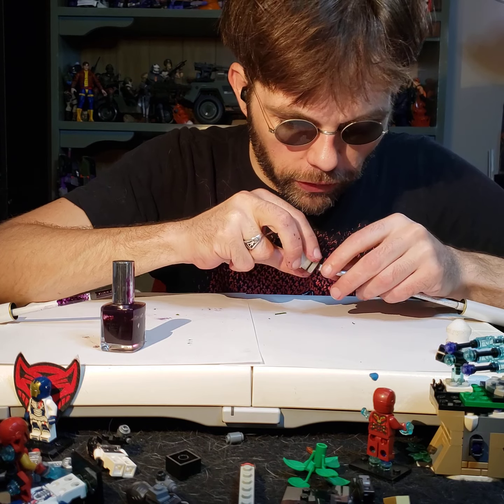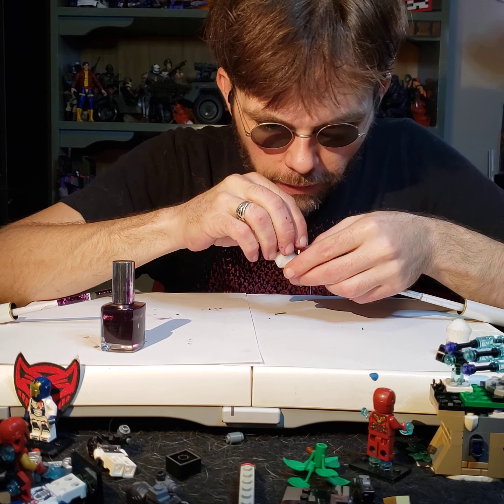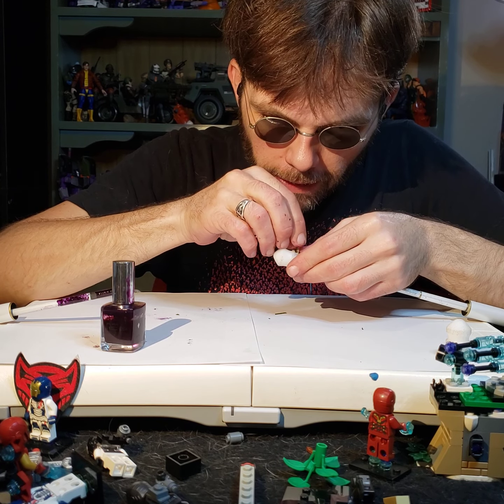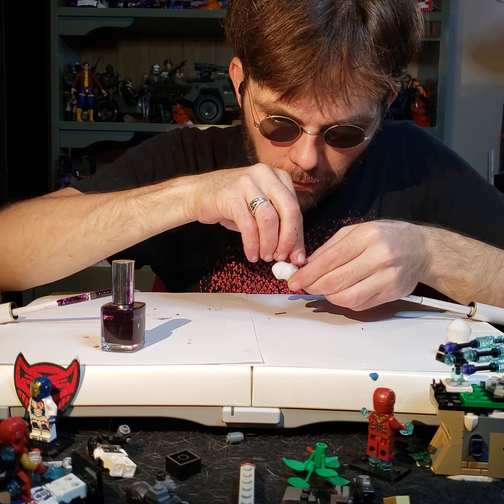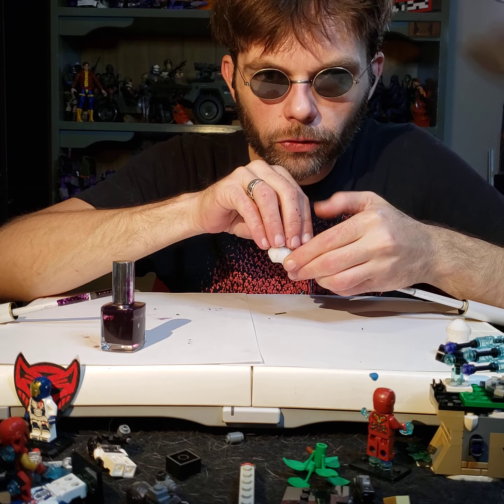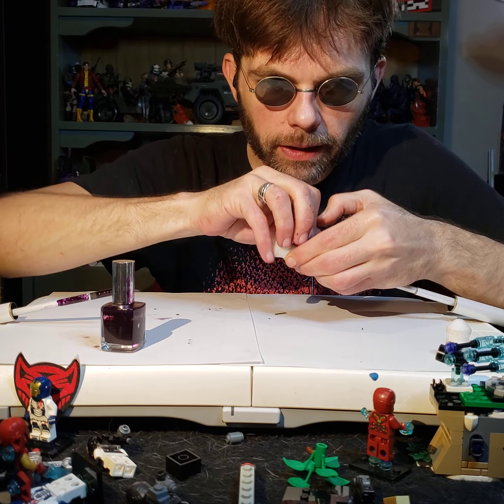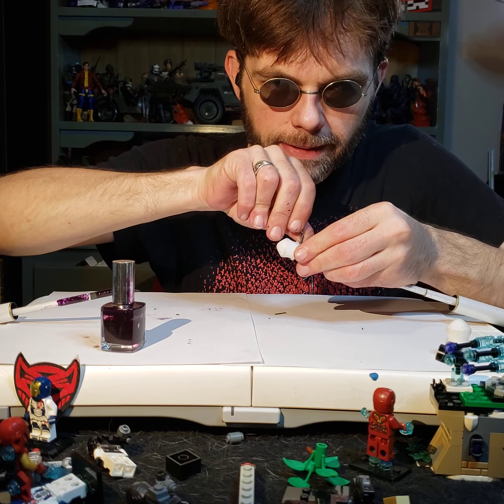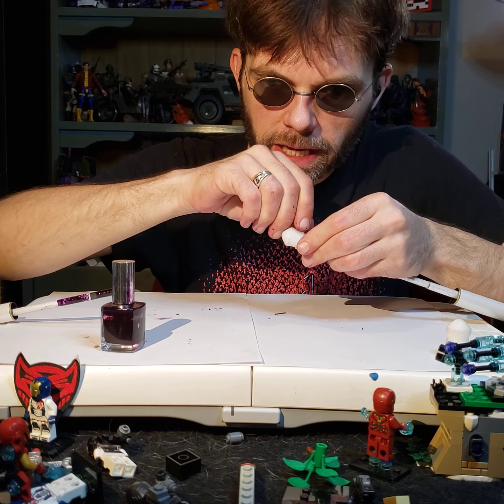Now let's put this guy back in here. Okay, slid it in. And find the screw. Go ahead and give it a tightness. Let's set the screw up. Come on, get in there. There it goes. Tip in the screw. Now, lefty loosey, righty tighty. And spinning it to the right, that's 2 rotations and a little more. There we go. Make sure that you can still move it.